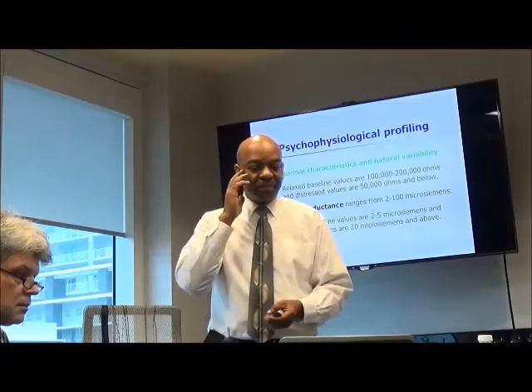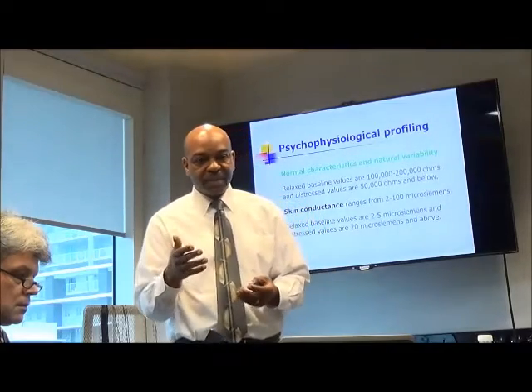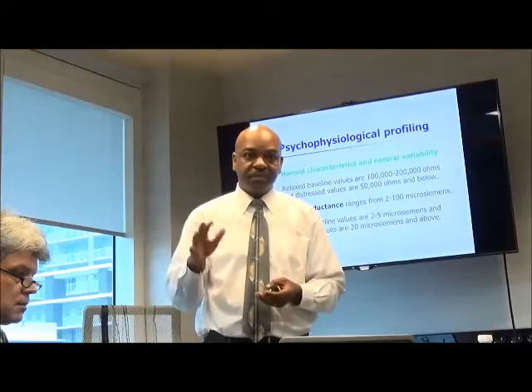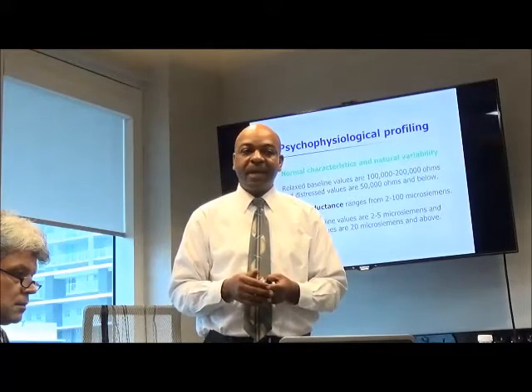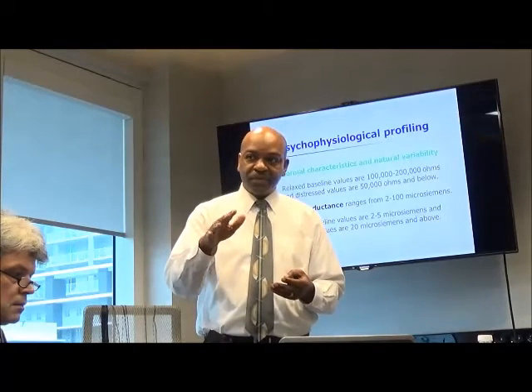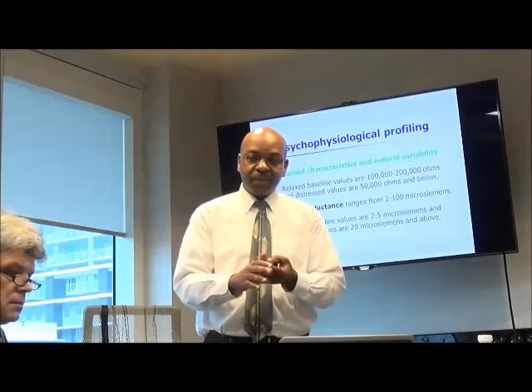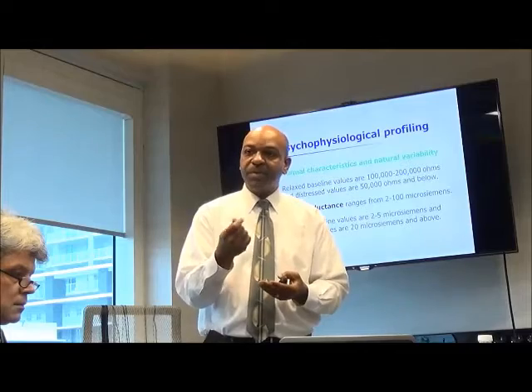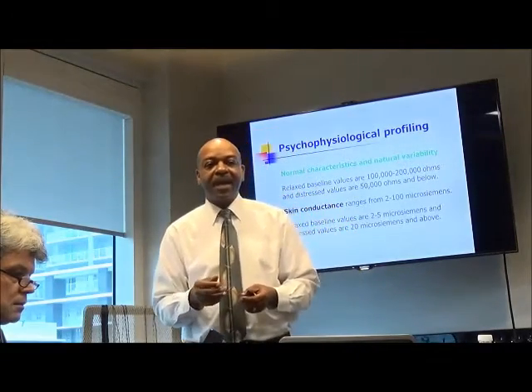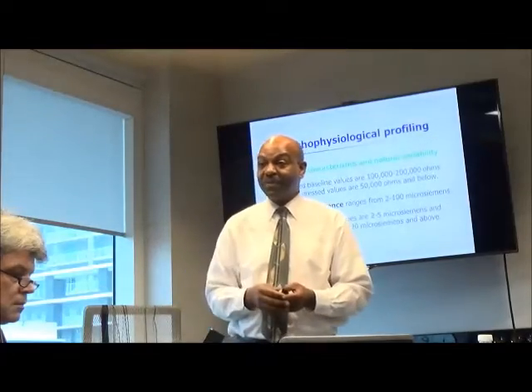I've seen a few people that I've worked with in the higher range, around 30. One of them, I remember, his hands would shake, and when you shook hands with him, you could feel the moisture on his hands. And you talked about coffee this morning.